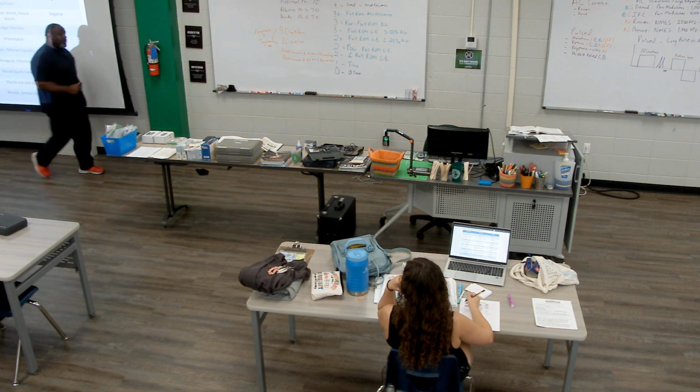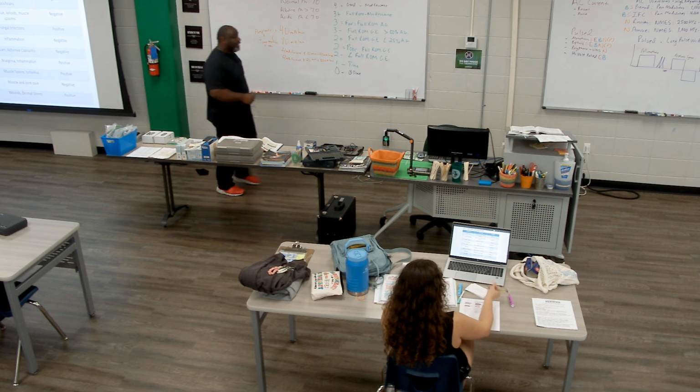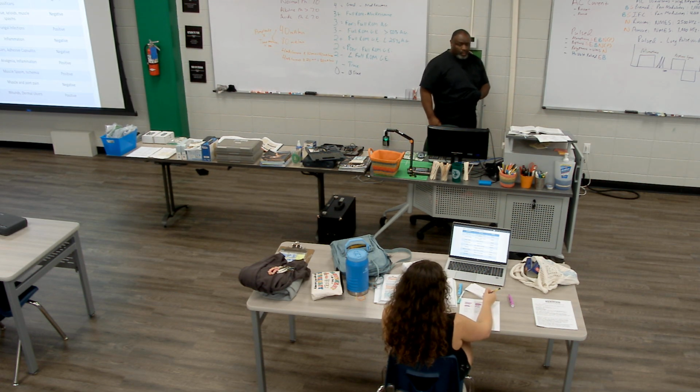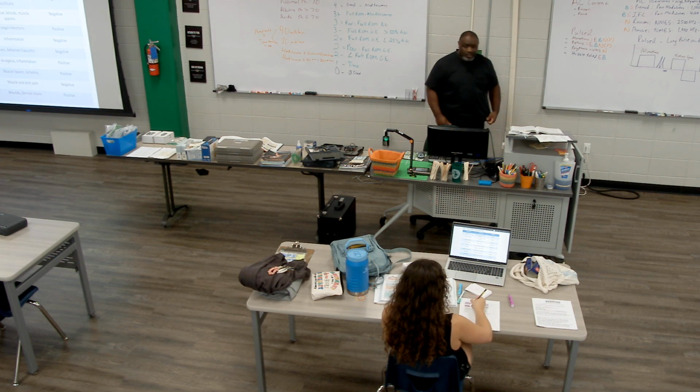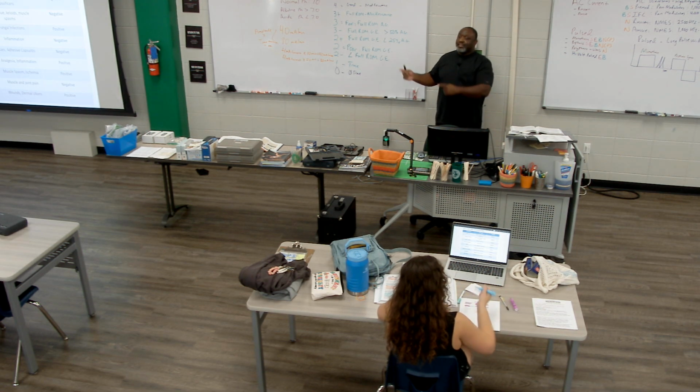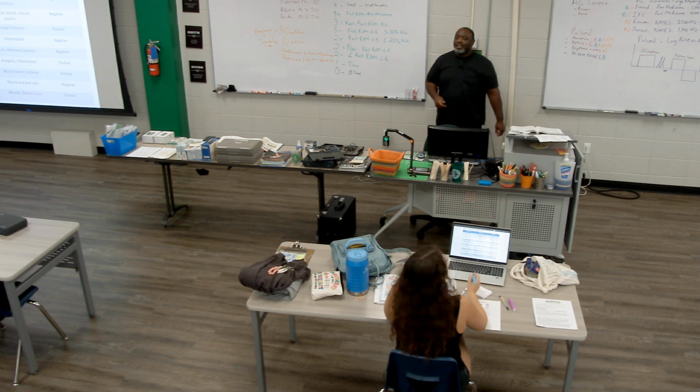So dex phosphate is one you're going to see clinically. So if it's one that you'll see, dex phosphate is the one. Iodine, haven't seen that one very many. Scars, adhesive capsulitis. Lidocaine is one that you may see clinically. A type of analgesia.